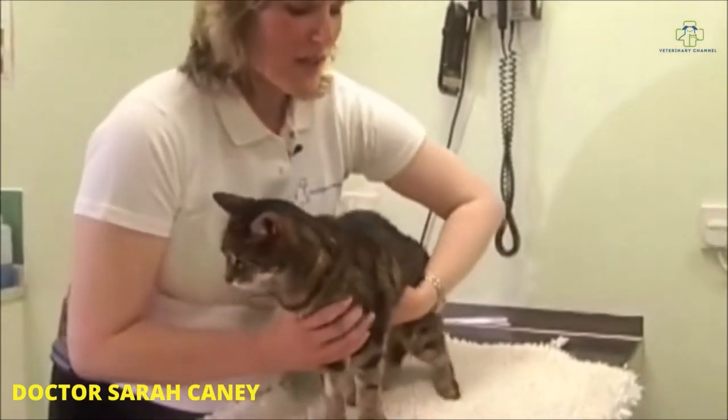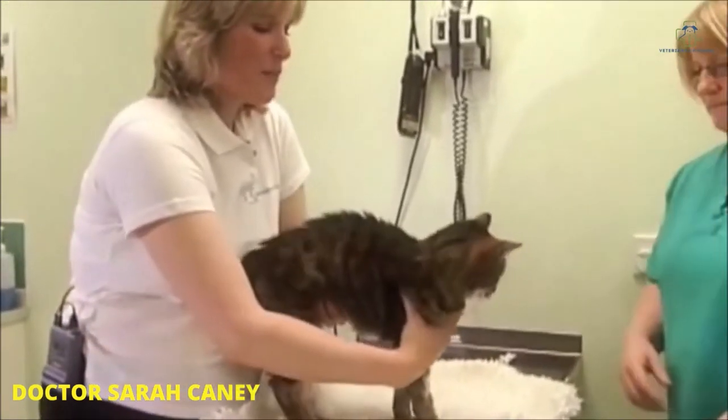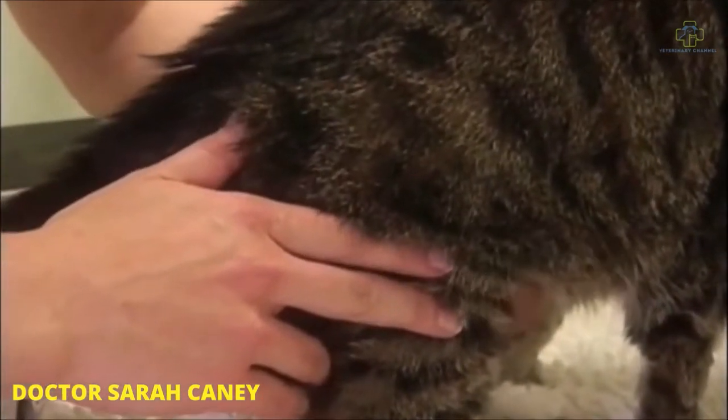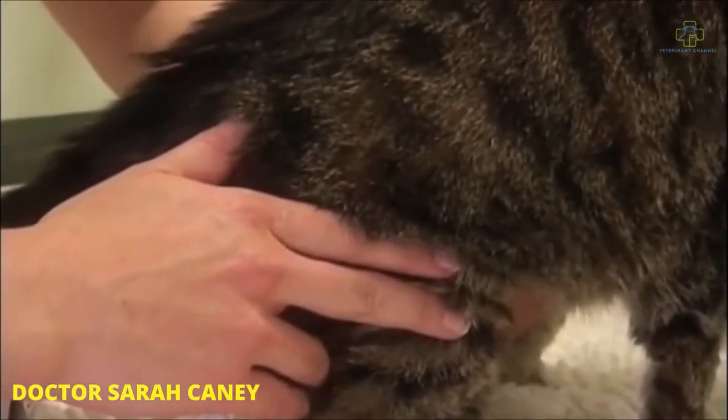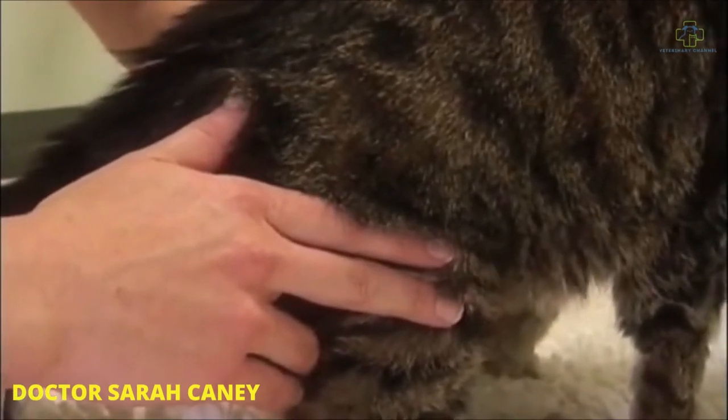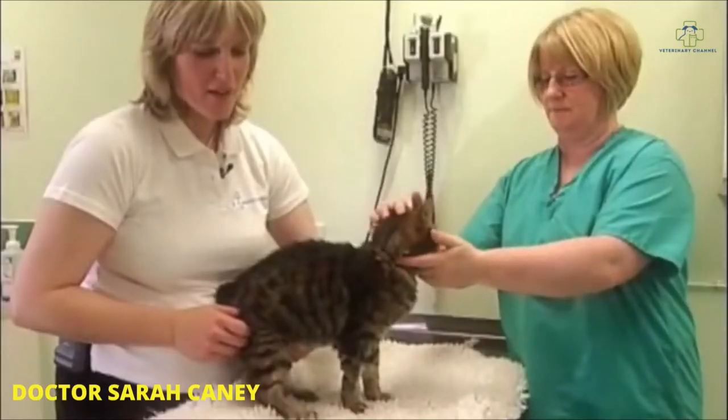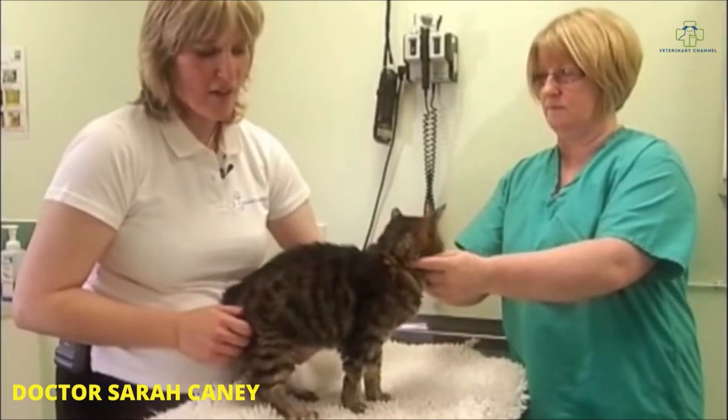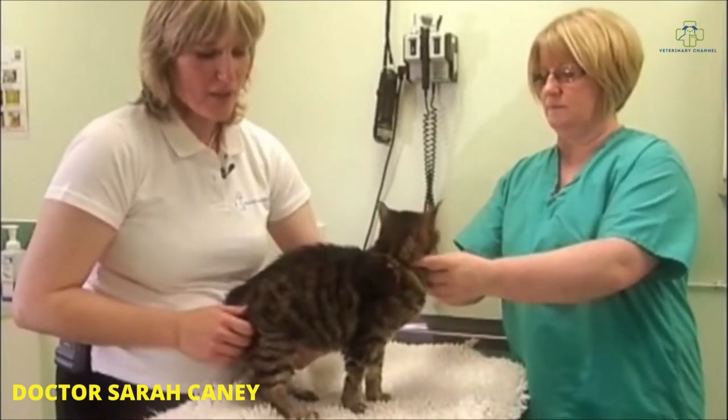The first step is to make sure that you can palpate the cat's bladder. If you can't palpate the cat's bladder, then you shouldn't stick a needle into the abdomen. If you find, either because the cat's very fat or because the bladder is very small, that you can't, then an alternative is to use ultrasound to guide you in placement of your needle.